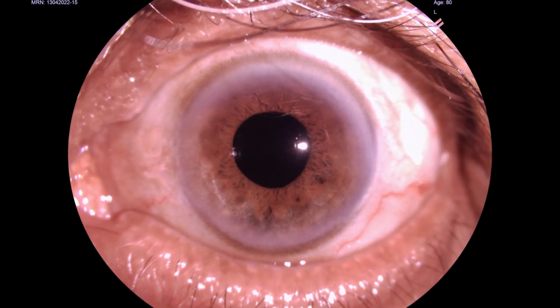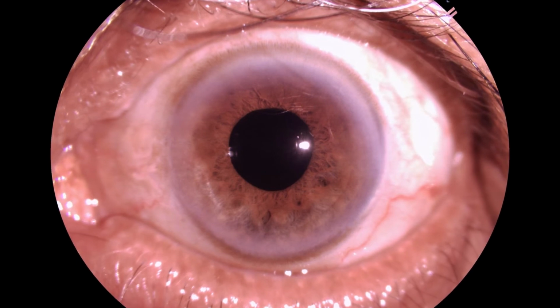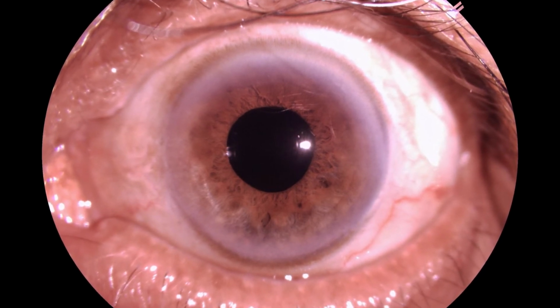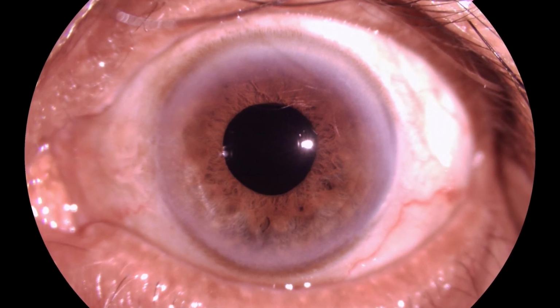This is the post-op day 1 picture, which is satisfactory in the sense that the IOL is well placed in the bag, the cornea is clear, and the visual gain was significant. Thank you.